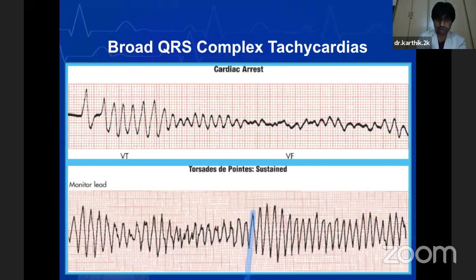You can see that the QRS is wide, there is tachycardia, the rate is too high, 250 to 300. You don't see any P waves here. It's only the QRS complex. But you have to see that there is a peculiar pattern of the QRS complex such that it is almost twisting and turning around its own axis, like a helical structure. So when this kind of ECG is seen in an emergency, you should immediately think of torsades de pointes, and these patients should be quickly resuscitated. They should be given magnesium sulfate to immediately revert the rhythm back to normal.